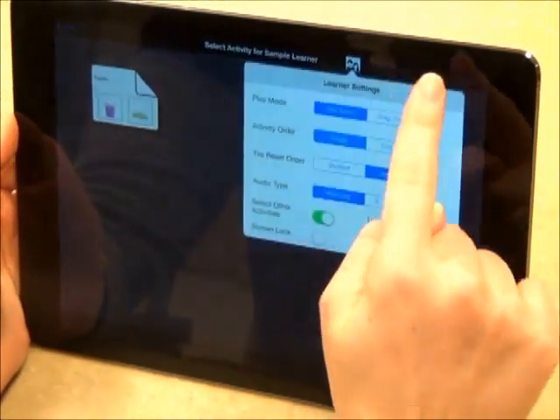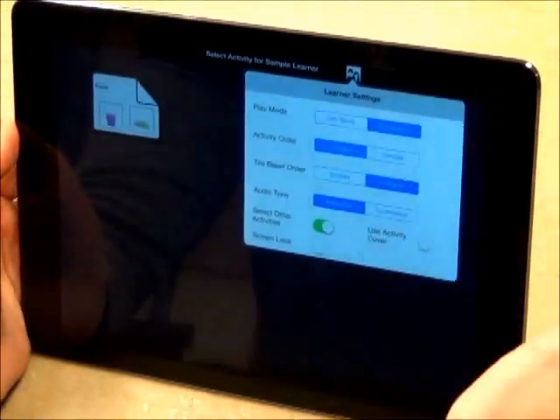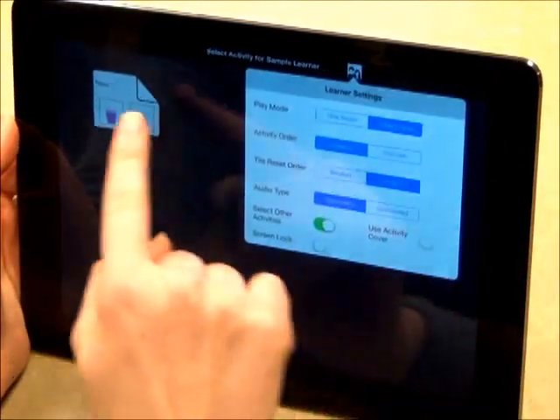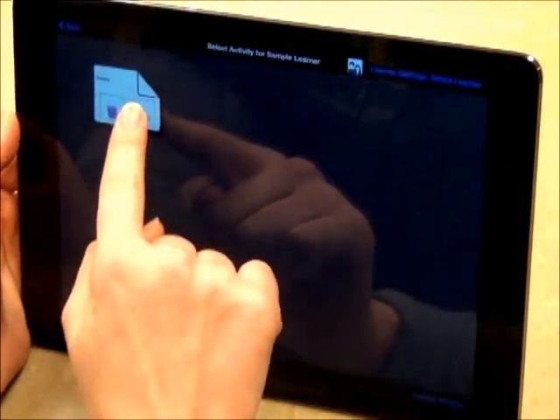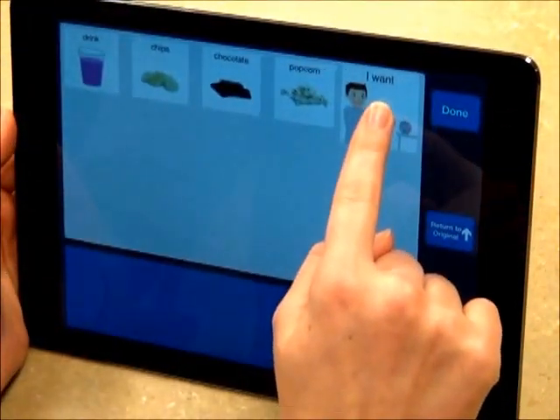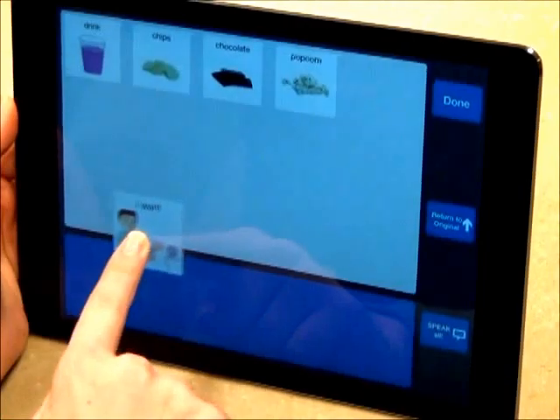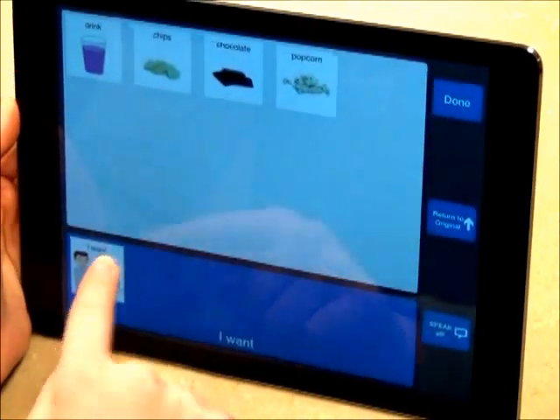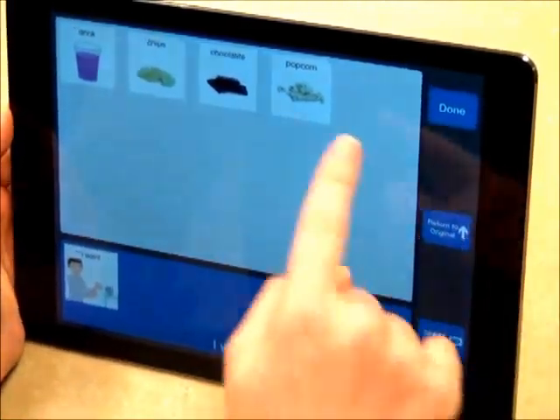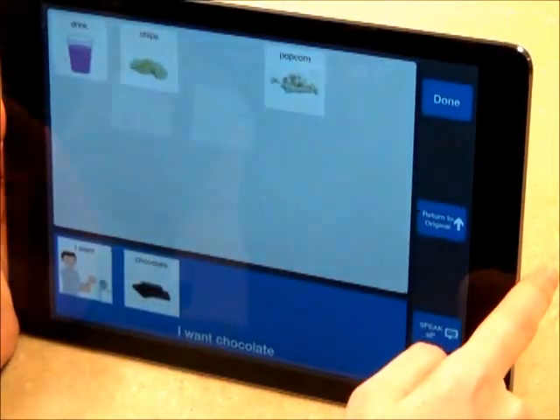For learners with better fine motor control, you may use drag and drop mode. Learners may then drag and drop individual symbols onto the sentence strip — I want, Chocolate.